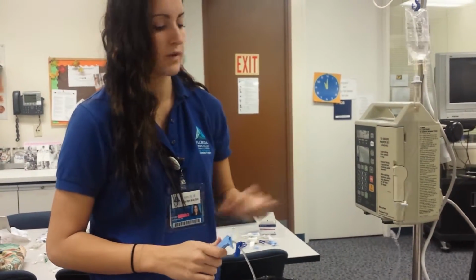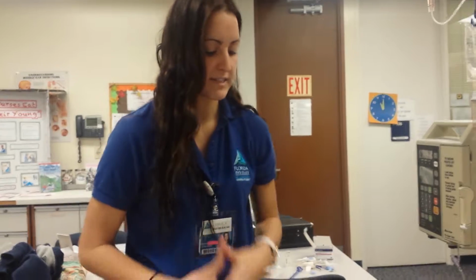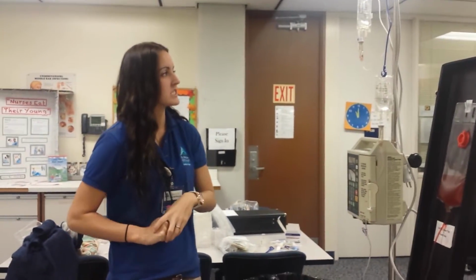So as long as it's going 100 an hour, and we've asked the patient how he tolerated it, he's got no burning or irritation at the site, everything looks good, no pain there. So at this point, everything's done. I'm going to leave the patient's room and go document on my MAR. I'm going to document the site that it was given, the rate, the concentration, my name and initials, what time it started, what time it's done, and that's about it.